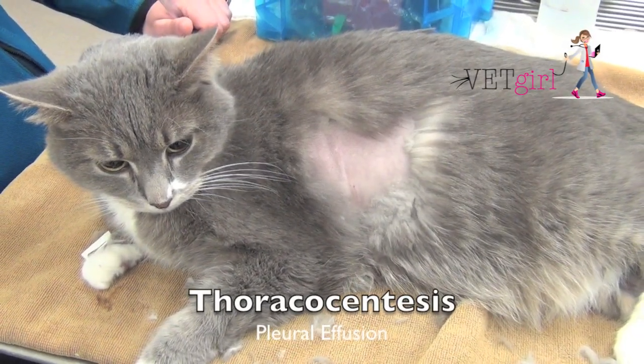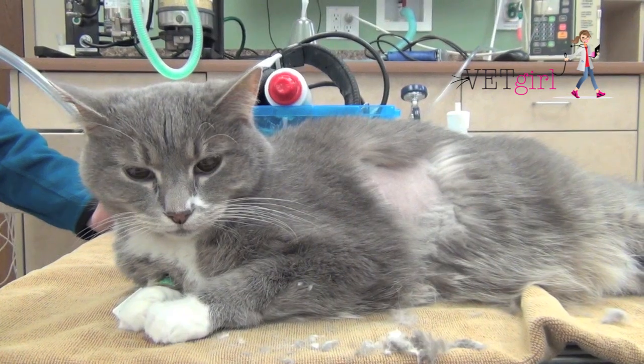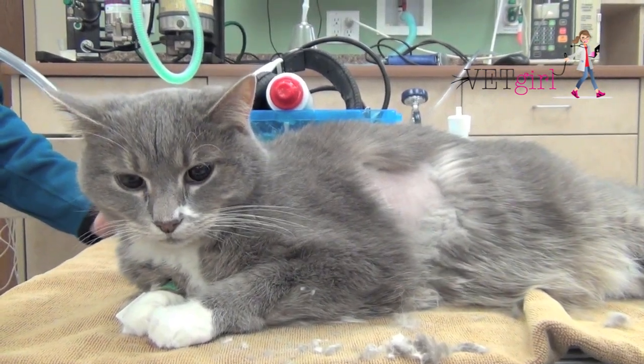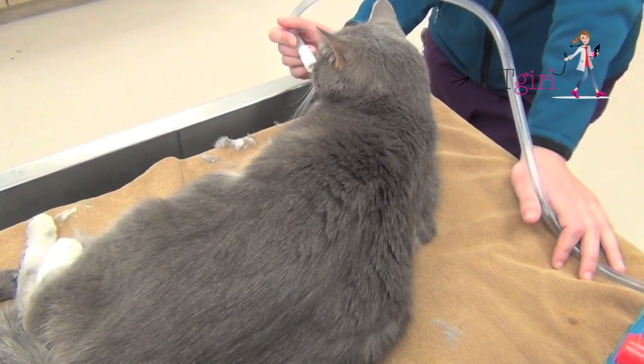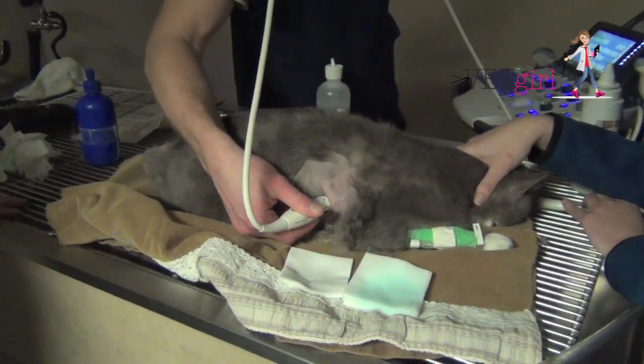In today's VetGirl video, we're going to demonstrate how to do a thoracocentesis. Whenever you see a dyspneic cat, we always want to have the cat in flow-by oxygen. We want you to feel comfortable performing a thoracocentesis because it's a life-saving diagnostic and therapeutic procedure.